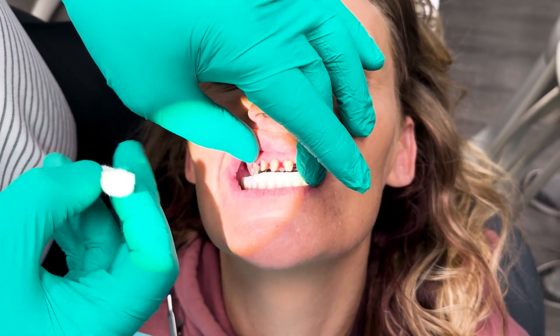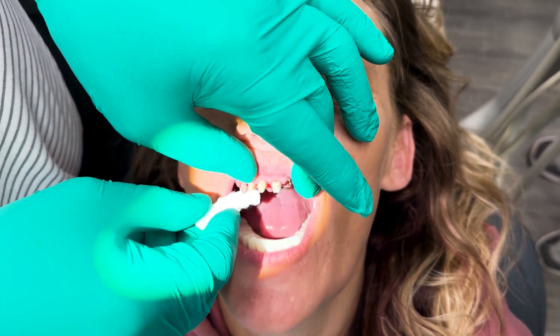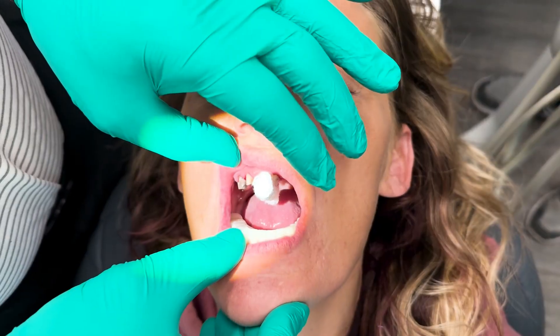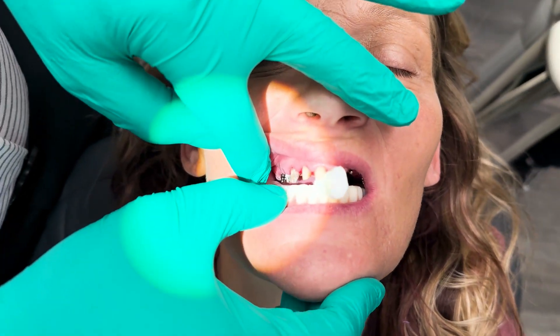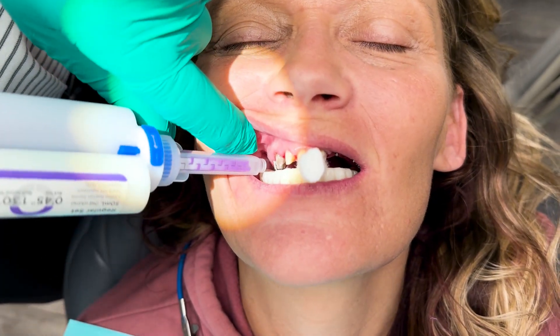As you can see, she's hitting here. Open for me and close together — a little tighter, nice and tight. Okay, open and close. That's good right there. With that, close together and hold it right there. What that does is it opens up a little bit of space, just enough for us to get a bite and to have enough room for porcelain. Bite a little tighter — right there. Can you hold it right there?